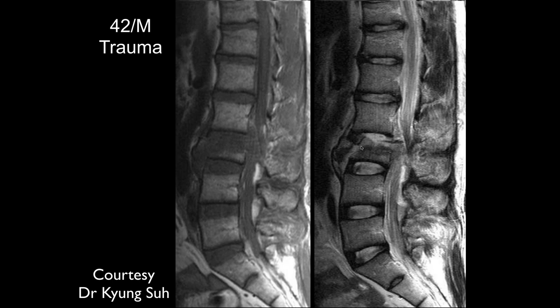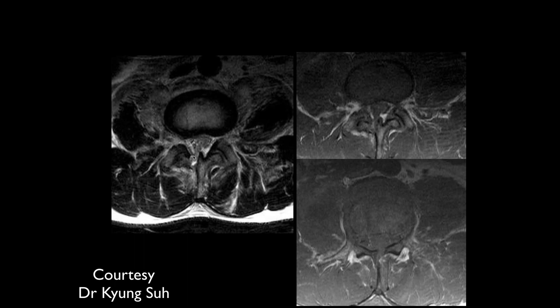Here we have multiple fragments and a fractured vertebral body. On axial images we can see the posterior elements are also involved, extending back through here, which makes it an unstable fracture. This patient has significant injuries involving everything inside.